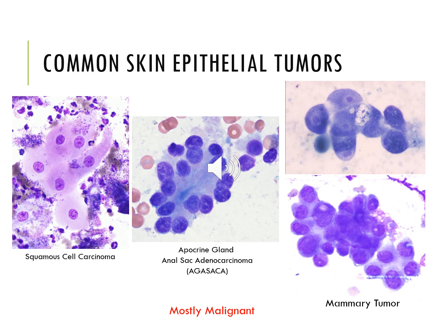And then when we discuss mammary tumors on the right here, so mammary tumors are very difficult to assess on cytology. If we see really marked criteria of malignancy in the sample that we get from a mammary tumor, then it is much more likely that it's malignant. I believe in a study that was recently done, I think 90% of mammary tumors that had marked criteria of malignancy on cytology were actually malignant when they were biopsied and evaluated on histopathology.